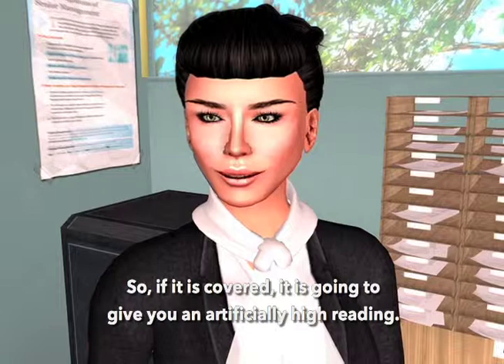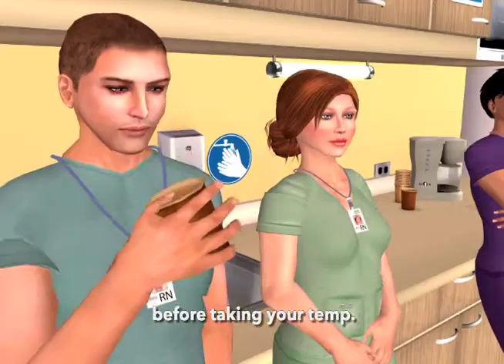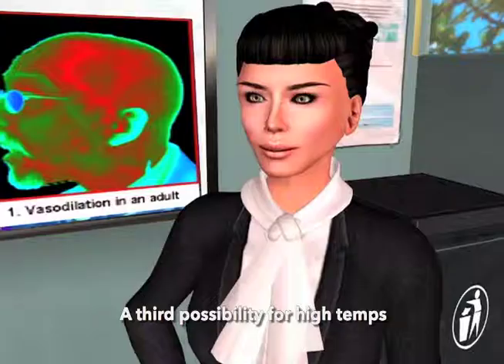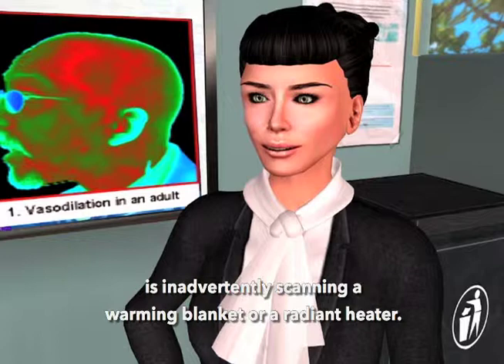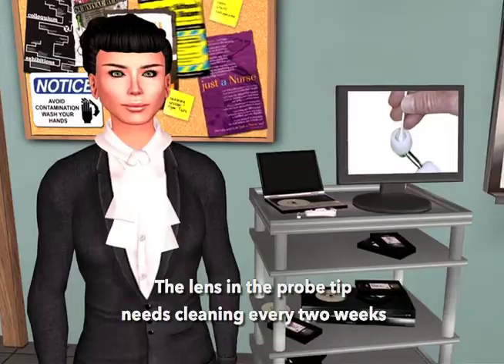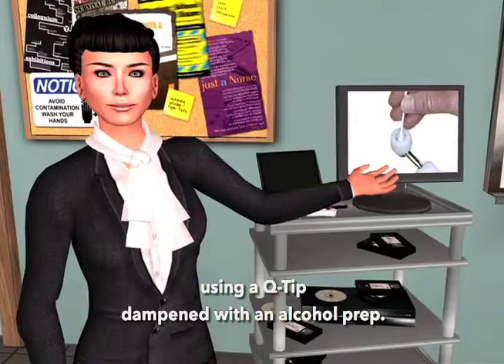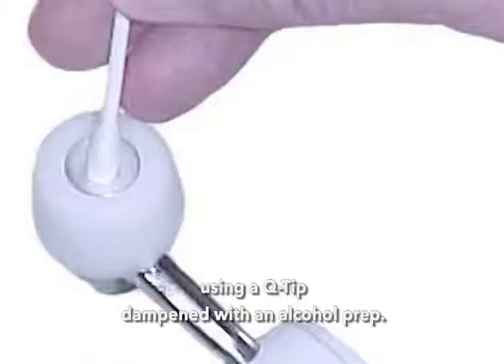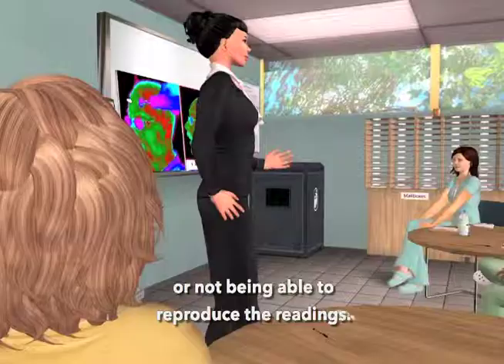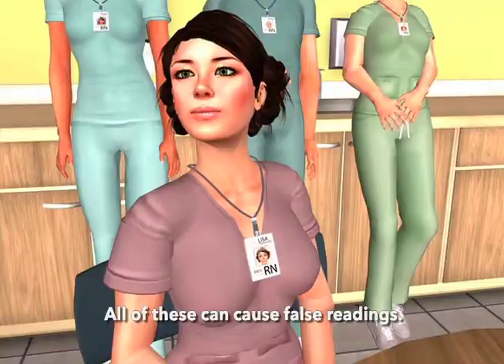Always allow about a minute after removing a covering before taking your temp. A third possibility for high temps is inadvertently scanning a warming blanket or a radiant heater. Low readings are typically a result of a dirty lens — the lens in the probe tip needs cleaning every two weeks using a Q-tip dampened with an alcohol prep. A few other reasons for low readings include curving down the side of the face, a sweaty patient, or taking multiple temps in rapid succession on the same patient — all of these can cause false readings.